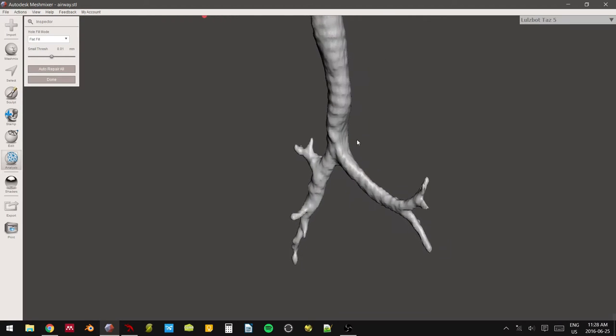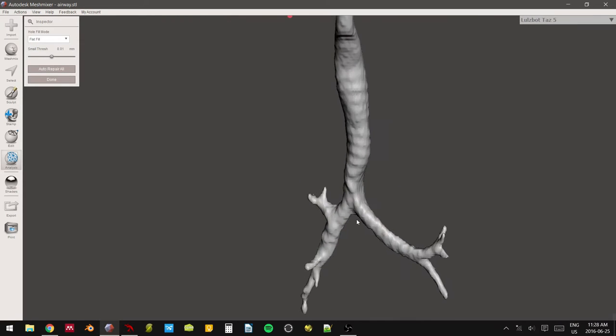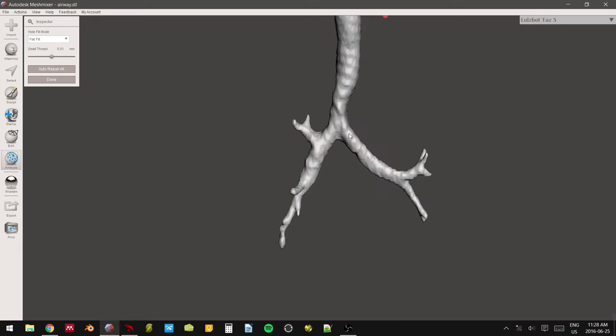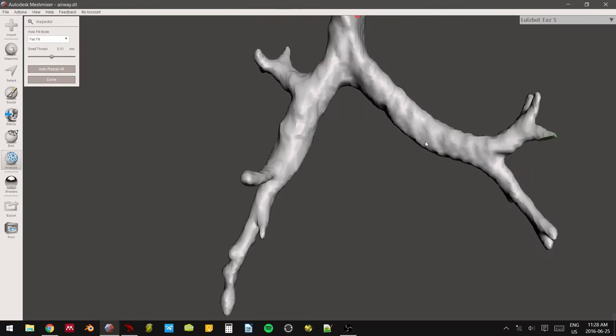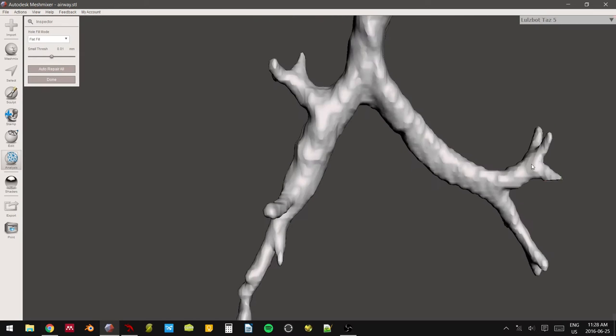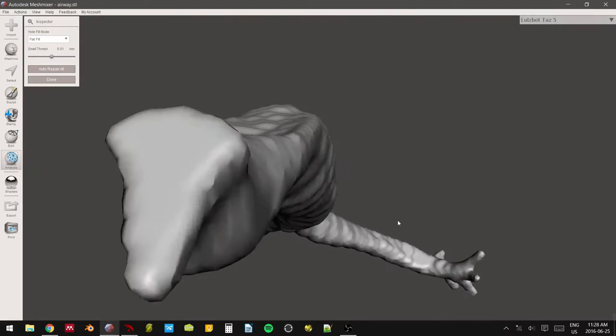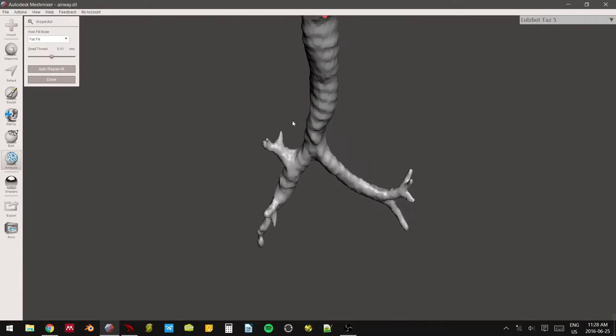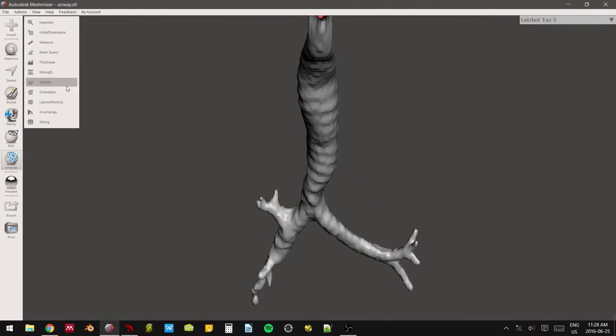So let's check with what we've got. Trachea, point bifurcation or initial bifurcation. We've got the left main stem, right main stem, right upper, right mid, right lower, left upper, left lower. Good.